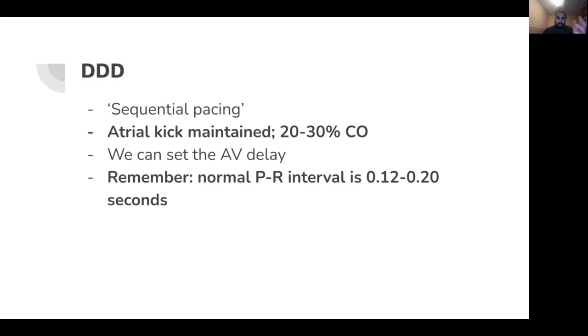And then you can see, if you're aware of that, there are a number of different scenarios that you can get in the case of a patient paced by a DDD mode. You may have that the atria is paced, but the ventricle isn't paced because the conduction system is intact. You may get that both need to be paced because the intrinsic atrial rate and the intrinsic ventricular rate are both low.